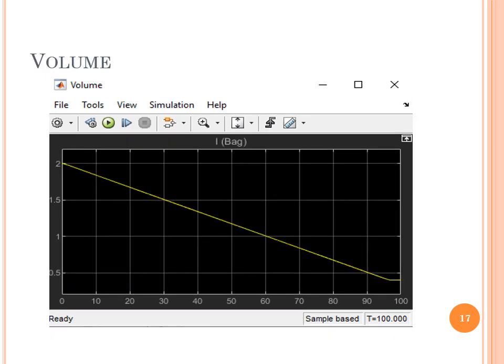As expected with a constant flow, the volume of fluid in the feeding bag decreases at a constant speed, as we see in the figure. It stops at 0.4 liters, meaning that a total of 1.6 liters was delivered, which is the maximum capacity of the model bladder.